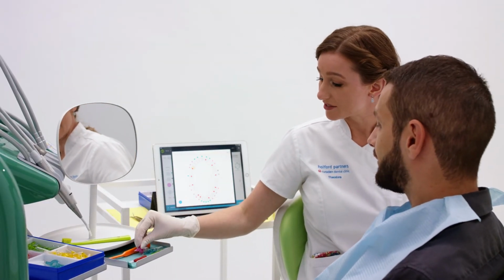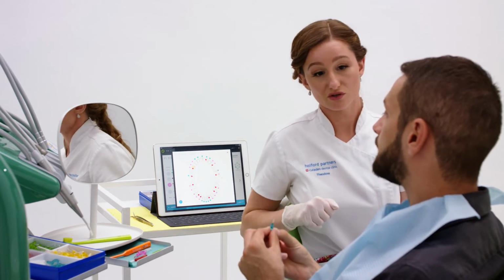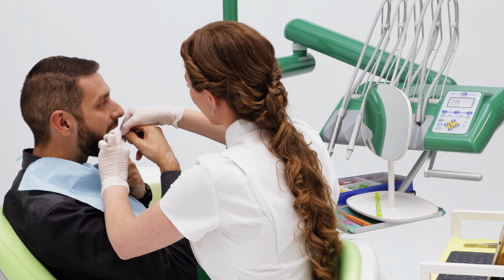I then move on to another sextant we have not used a brush with yet. Here I demonstrate the turquoise prime again and assist with his technique, as it will be slightly different compared to using it on the upper anterior teeth.